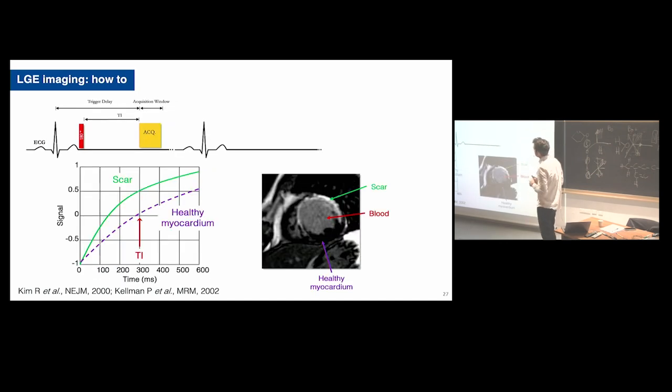So we have the sequence, and we can simulate this sequence. Yesterday, with Professor Ekberg, we heard about the Bloch equation, and this is a very efficient tool. We could simulate this technology and see the behavior of the signal over time. And if we do that with this inversion recovery acquisition, we have this kind of behavior.